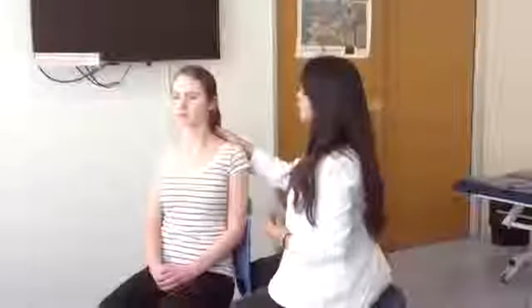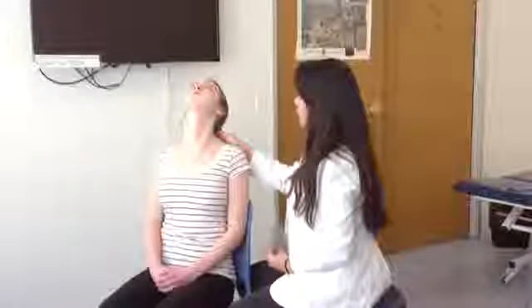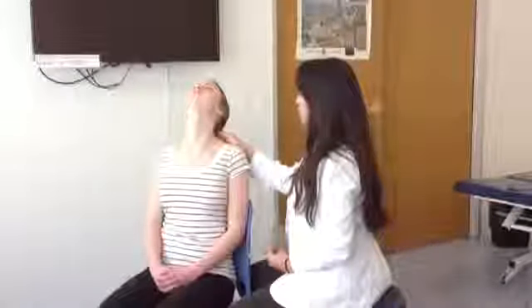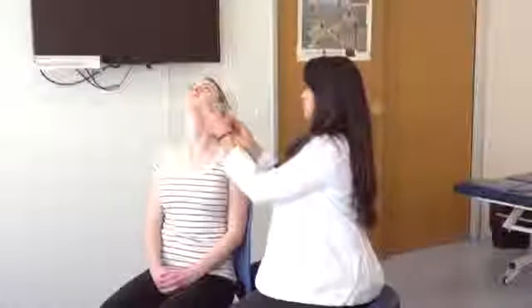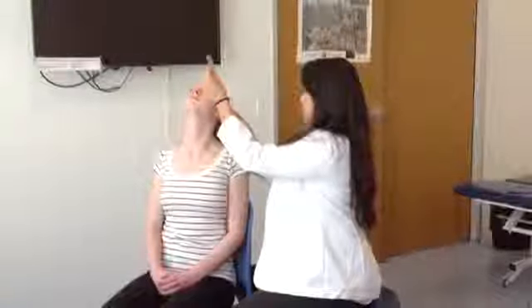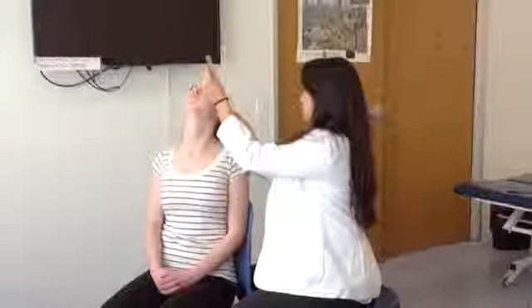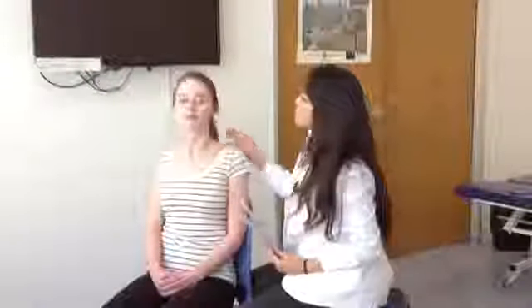Okay, now go ahead and tilt your head back, and I'll tell you when to stop. Okay, just hold it right there. And you are at 56 degrees of cervical extension range of motion, which is normal. Normal is 55 to 65. So good job.